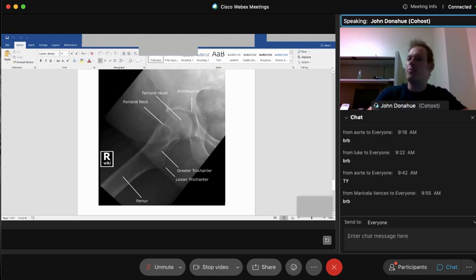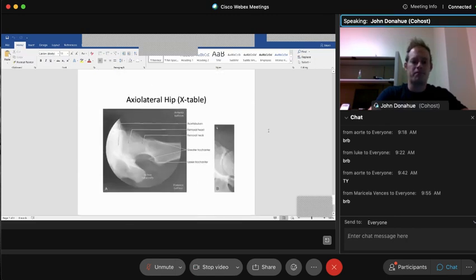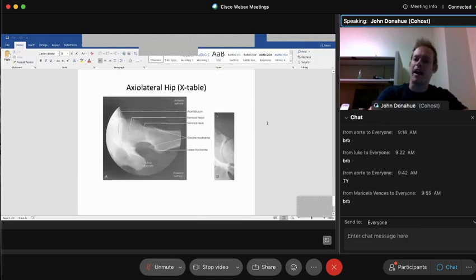Know the difference between AP hip and lateral hip, guys. The anatomy does change, depending on how those trochanters are lying. And that's going to be the Danelius Miller there, guys. Danelius Miller will always be shown in this fashion, where the femur is going horizontally. You'll also see the ischial tuberosity distinctly displayed. This is only part of the name, by the way, axiolateral hip. You can call it an axiolateral hip or Danelius Miller method hip. Both are acceptable.